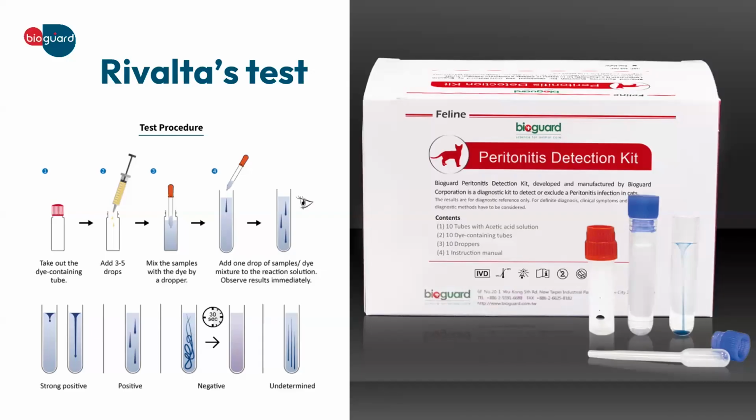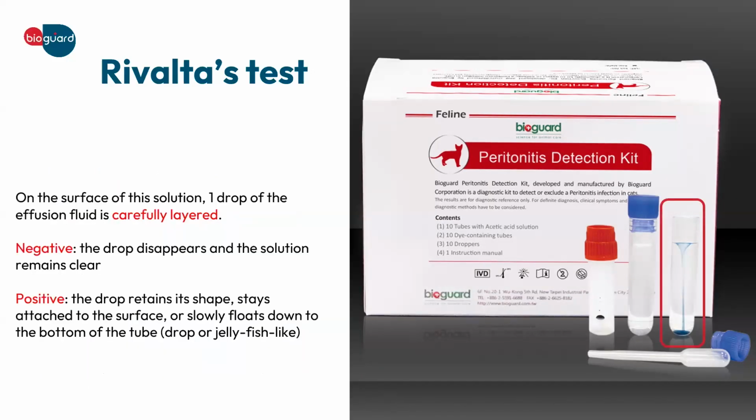that will be very clearly observed as a sign of FIP. As you can see in the picture, if a straight, uncut line is formed from the drop, from the surface to the end, then it's a strong positive case. However, if the liquids start mixing in the buffer, then of course it's negative. And if multiple lines are formed, the result is still unpredictable and you need to do some further testing.